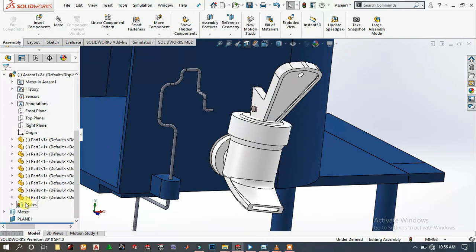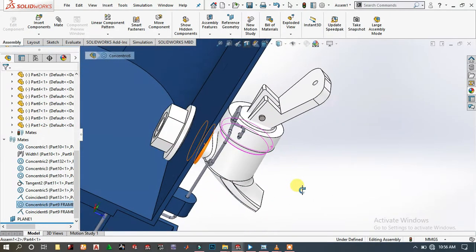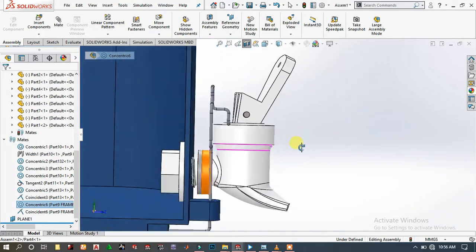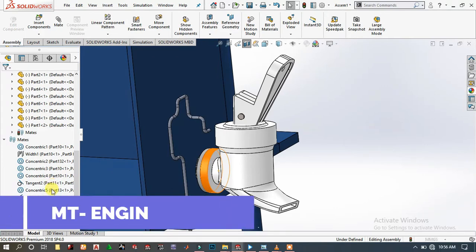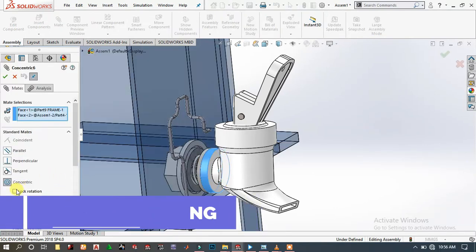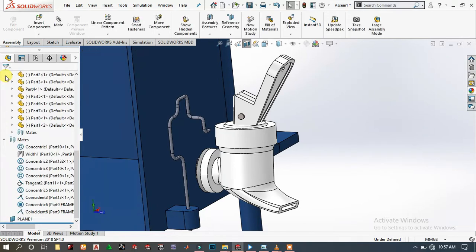Here I think it is in the right position, so we have to specify to lock this rotation, the rotation of this tap. So we have to choose this concentric mate and edit features. We have to edit this. Only choose the lock rotation checkbox, then click OK. Now it will not rotate.